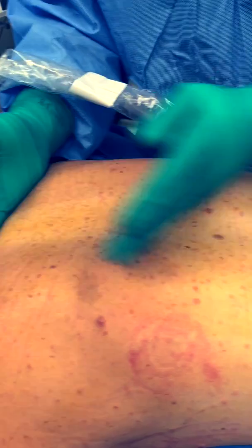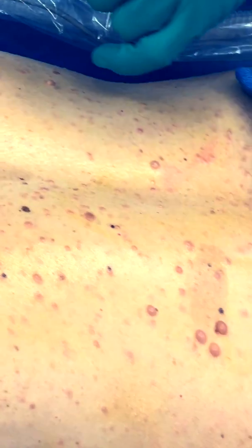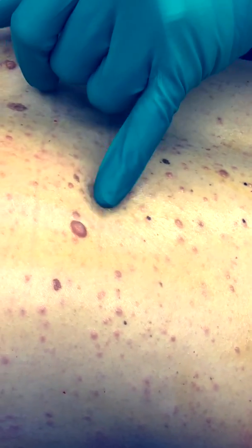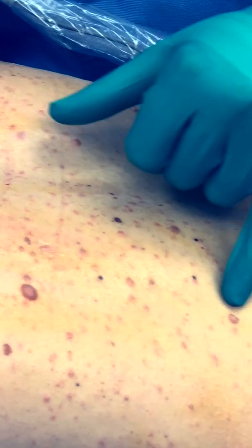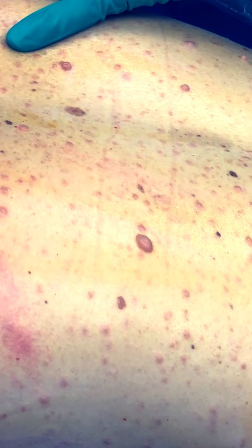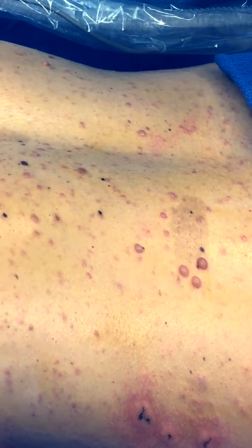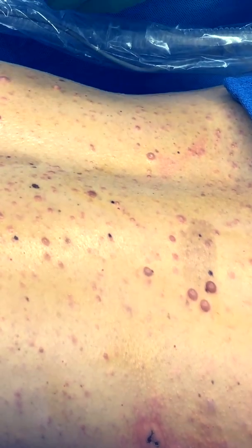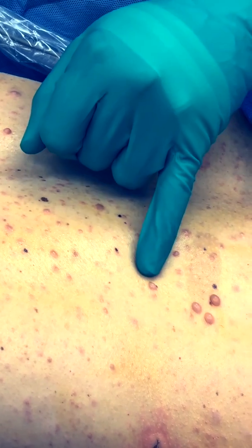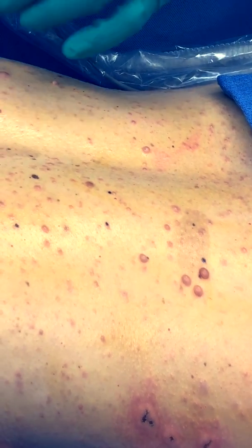This is what electro desiccation is — it allows me to go through an entire anatomic area like the back and treat it virtually completely if the bumps are small enough. Determining that takes experience. I perform electro desiccation on virtually all of these bumps but some respond better than others. I'll zap one, keep working across the back, then revisit it later in the surgery. That allows swelling inside the tumor to pop out through the hole created by electro desiccation, helping me get the root better. If I didn't come back, some might herniate out and then have to shrink back, which doesn't always go as planned.